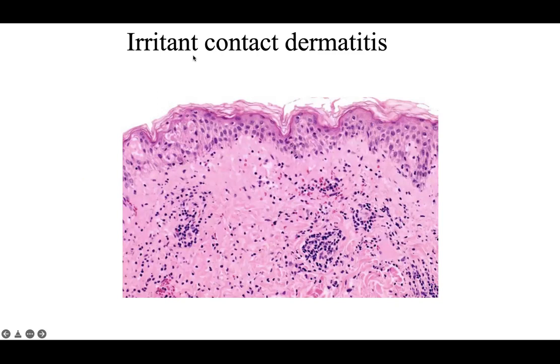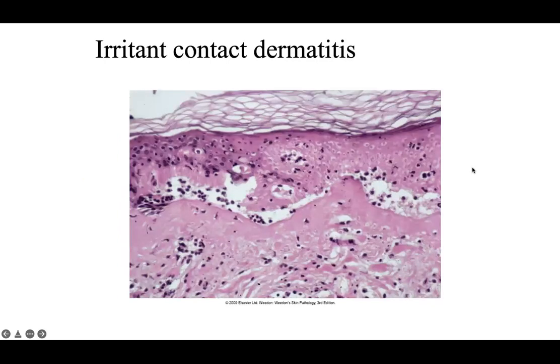And this is due to an irritant contact dermatitis. So you see this just overall unhealthy look to the epidermis here. It's bordering on some full thickness necrosis in some areas too. So that direct toxic effect. Here you can actually see an area that looks like more full thickness necrosis underlying the basket weave stratum corneum here. And remember, the stratum corneum is composed of dead keratinocytes already, anucleate dead keratinocytes. So you can have preservation of the architecture here of the stratum corneum. But the striking pathology here is this really diffusely necrotic epidermis.